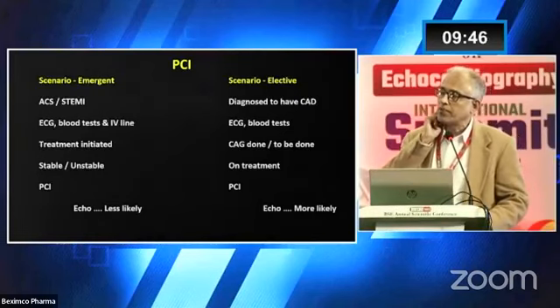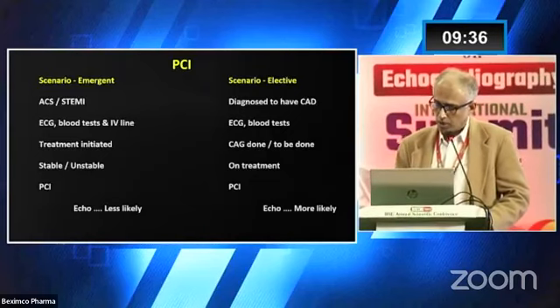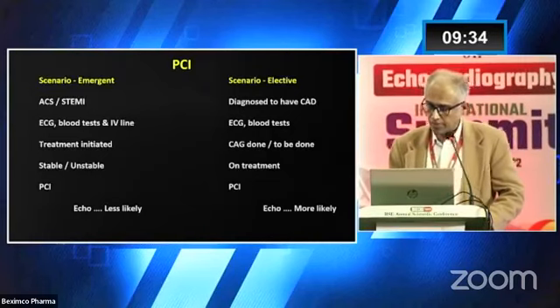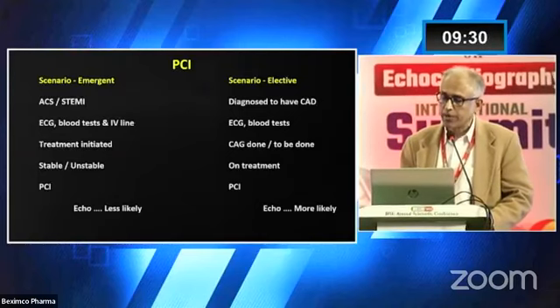And at this point of time, echo is given a low priority, but it is very important to remember that it can cause a problem later on. In this hurry, it has been repeatedly shown that if echo is missed, other findings missed at this stage will create problems later on.